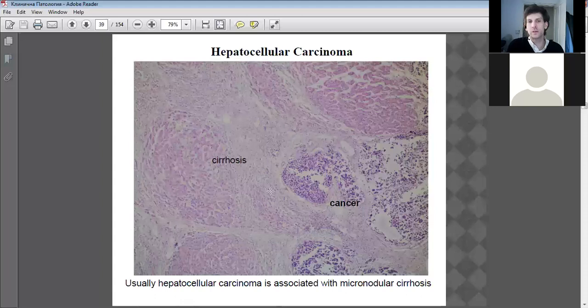Problem is that the nodules block normal cellular function. Yeah, notice the color difference. This is very abnormal cell division. This is normal cell division, but being damaged by cirrhotic changes.